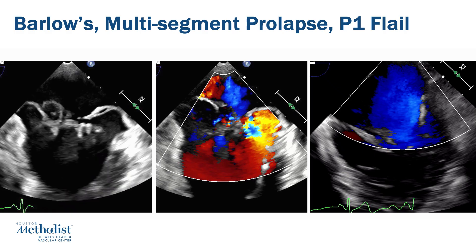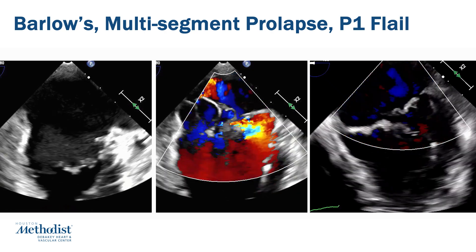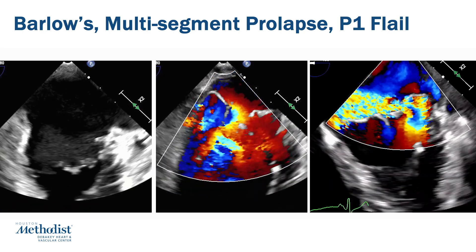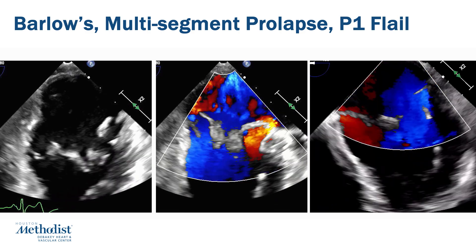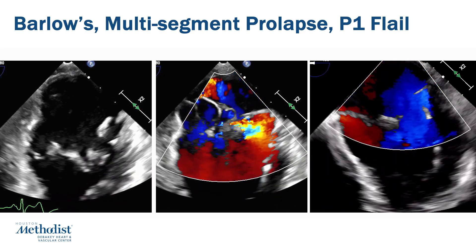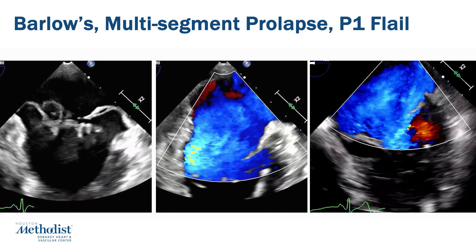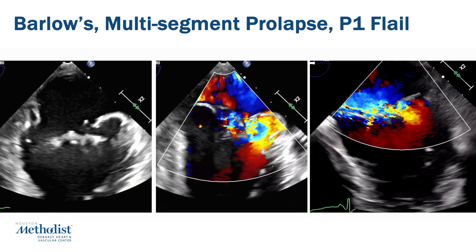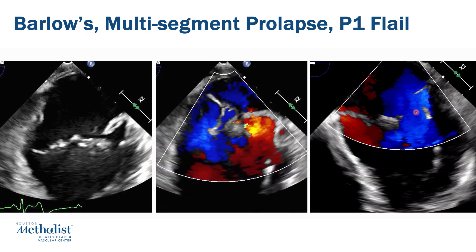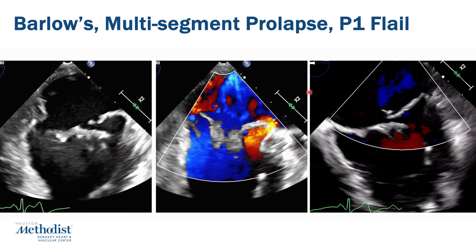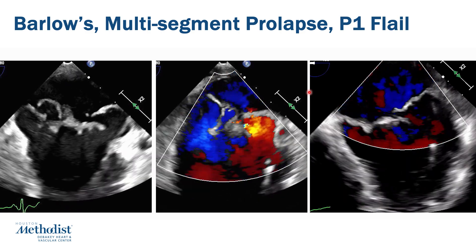Here is the transesophageal echocardiogram with and without color, clearly demonstrating a very degenerated mitral valve with multiple prolapsing segments and a flail in the P1 scallop region of the valve, with very severe eccentric mitral regurgitation directed from the lateral aspect to the medial aspect of the valve. Very severe torrential mitral regurgitation and a very degenerated mitral valve.